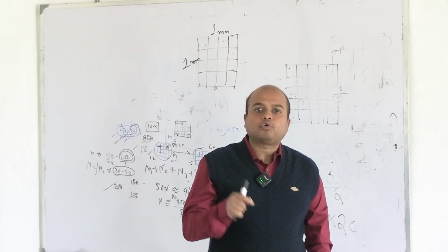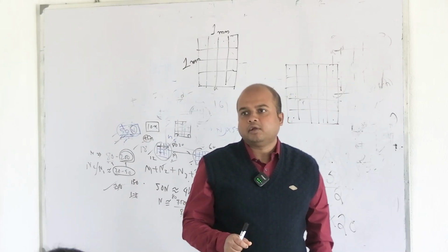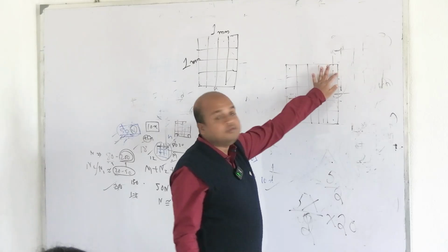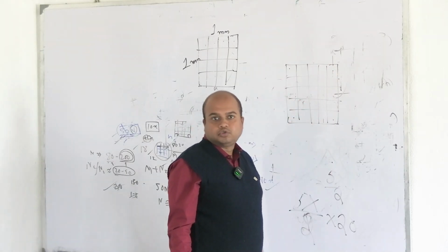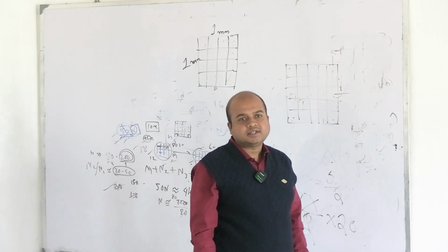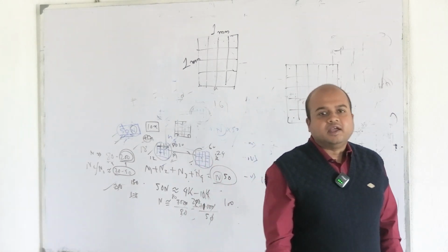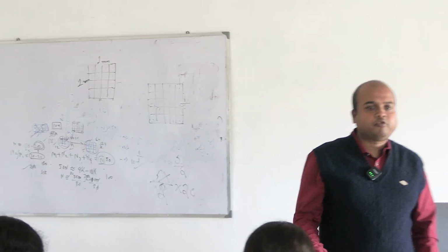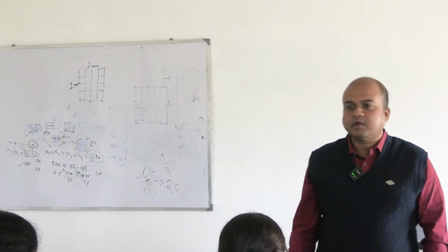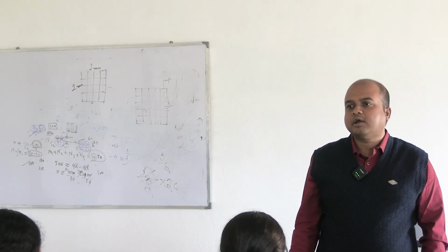Now, why the 4 corner and the central square only? Why not these 5 or these 5 or any 5 according to our choice? Why not? What can be the reason? I think some things are made out of common sense, so maybe that's why they are not written in books. Why do we count the 4 corner squares and the central square?